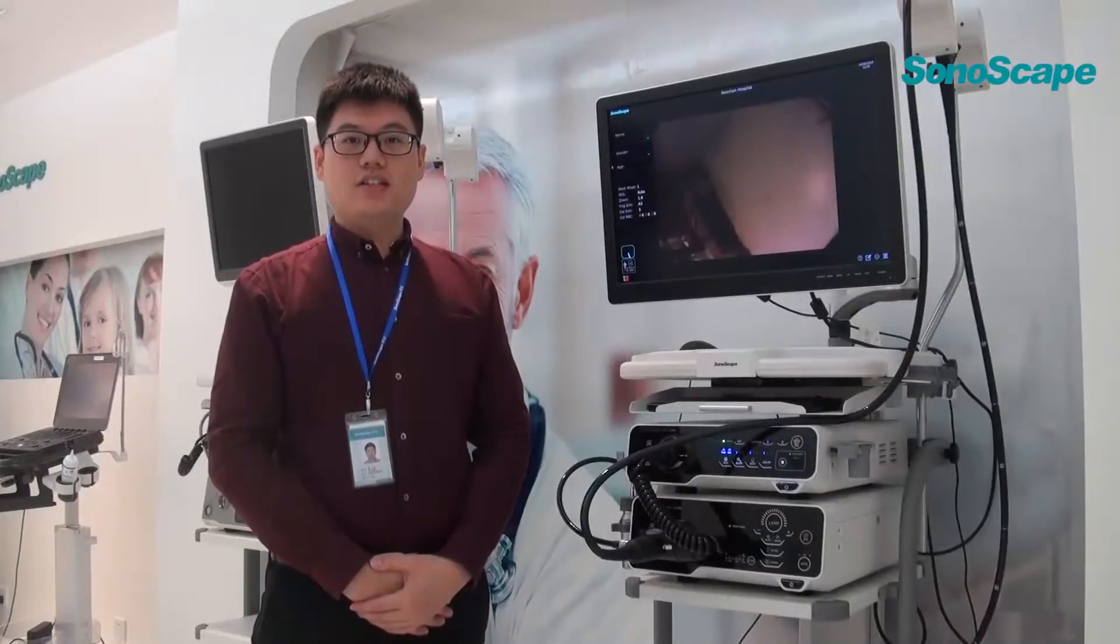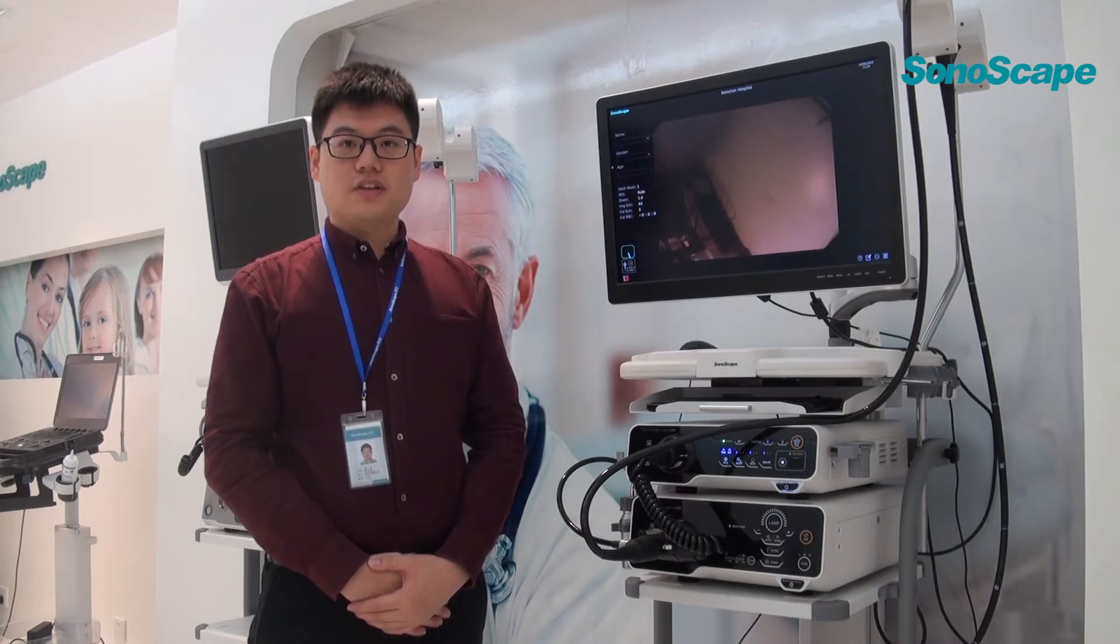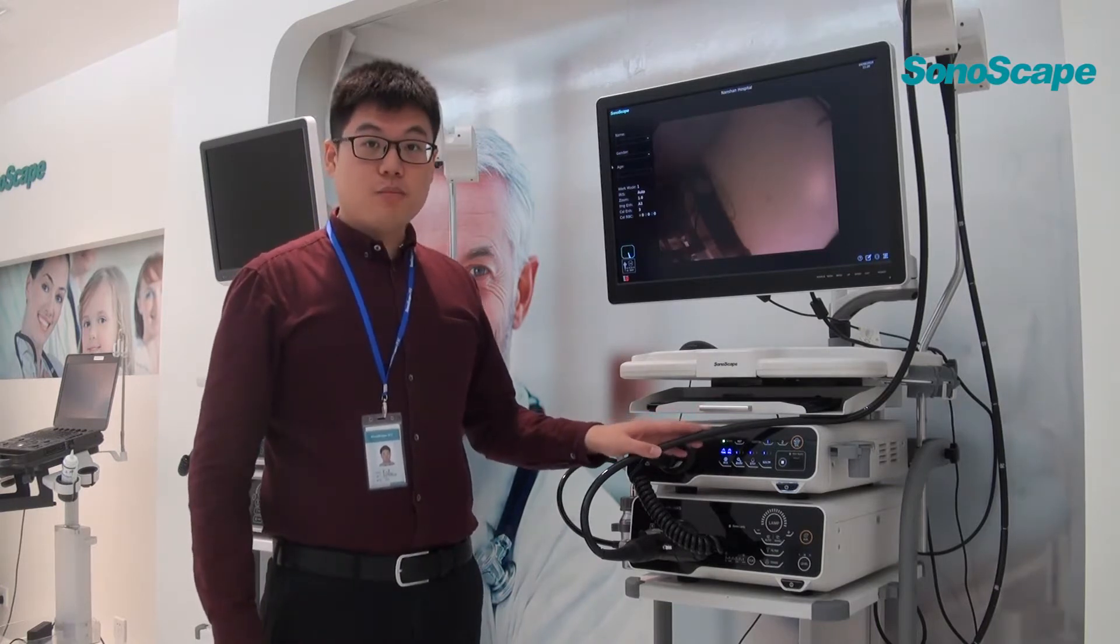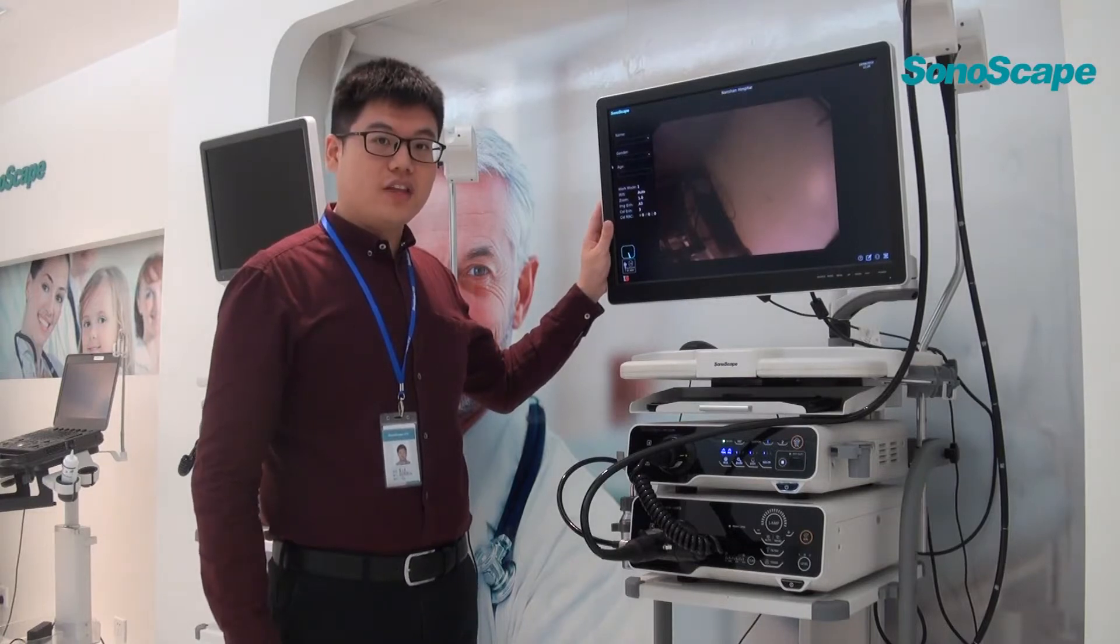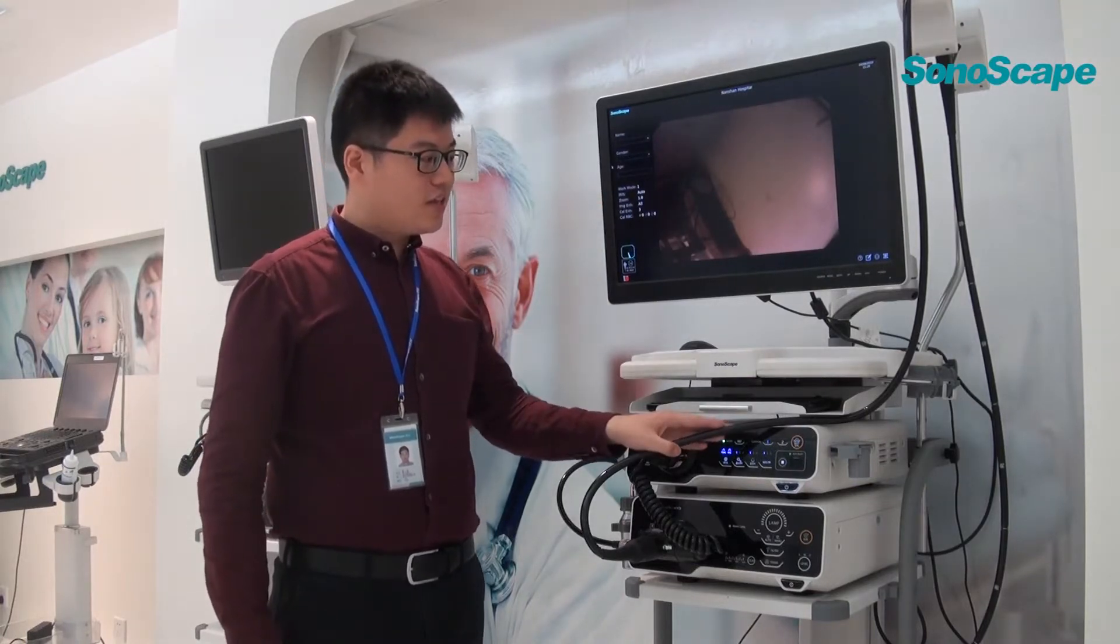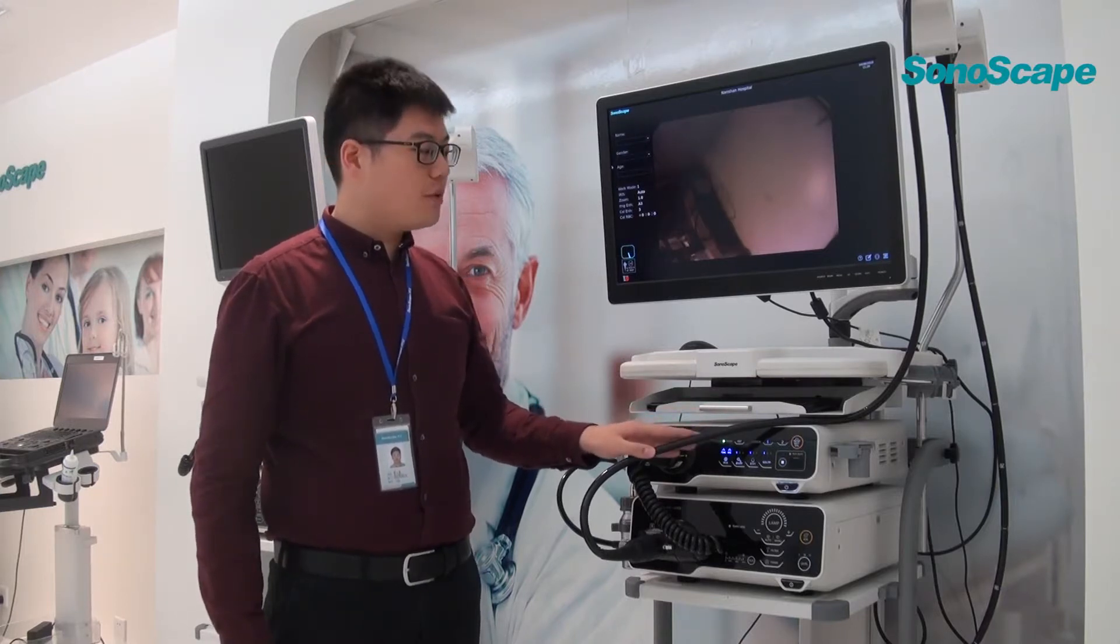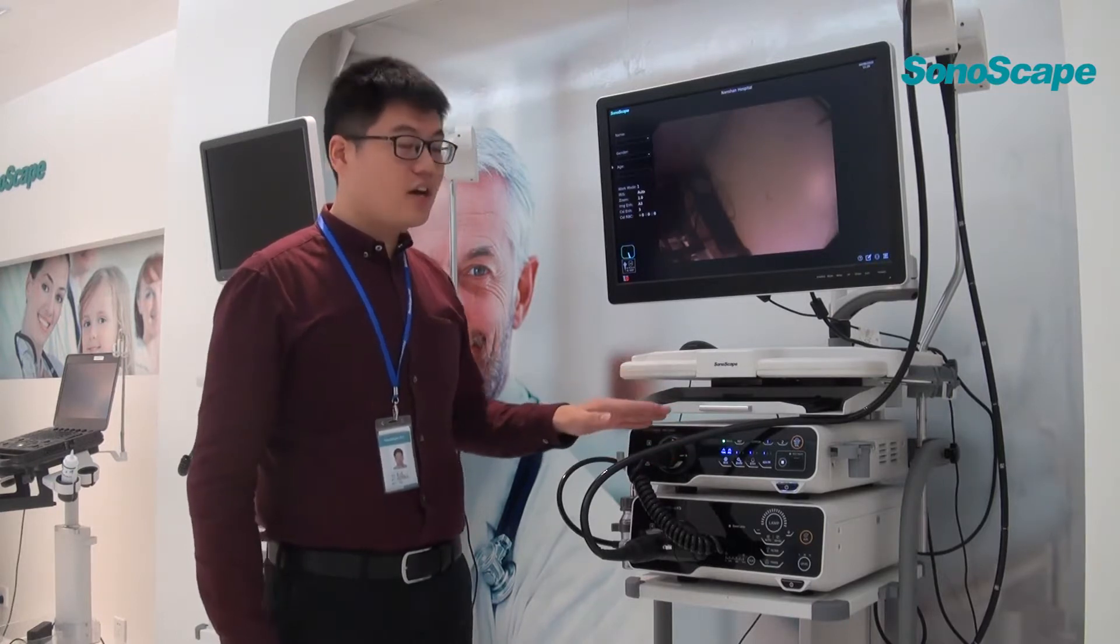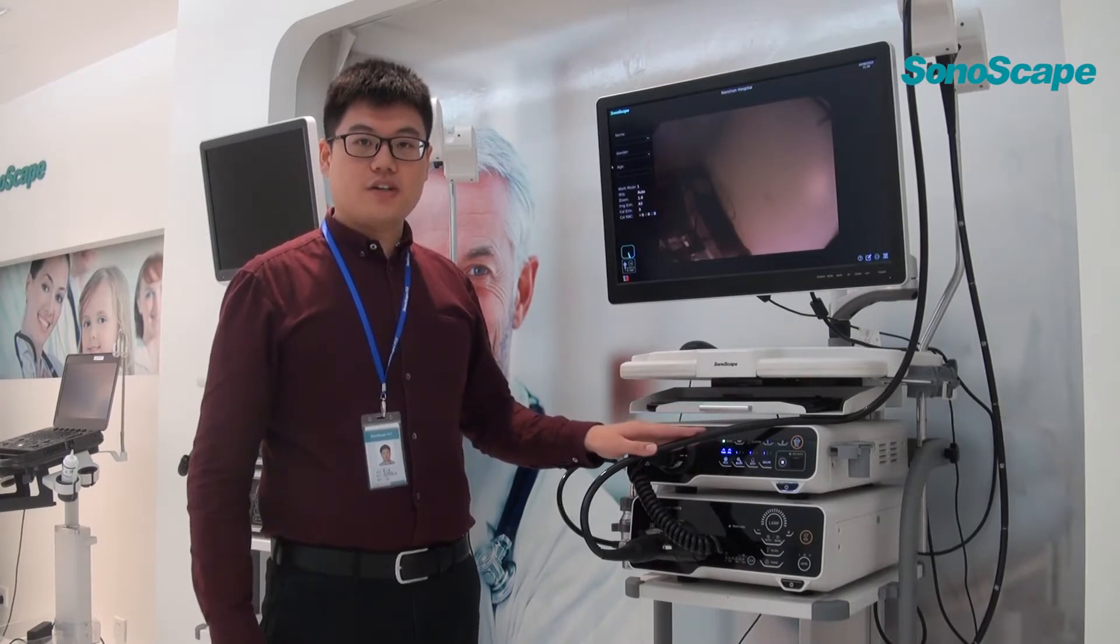Generally speaking, the HD500 system has three biggest features. At first, for the endoscope itself, it adopts high-definition CMOS technology to ensure the clarity and sharpness of the image. Six different sizes in working lens and instrument channel diameter can be well used for common diagnosis and therapeutics. All the GI endoscopes are with auxiliary water jet function.